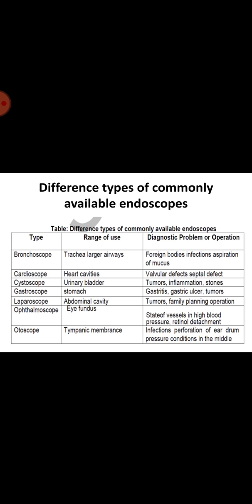Capsule endoscopy was developed in the mid-1990s and involves a wireless camera. The camera is small enough to fit into a capsule and can therefore be swallowed. As the capsule travels through the digestive tract, it takes thousands of pictures, which are transmitted to a device attached to a wearable belt. Capsule endoscopy is used to image the small intestine, a region that is difficult to image using a standard endoscopy.